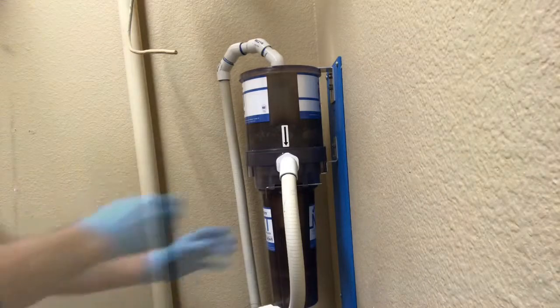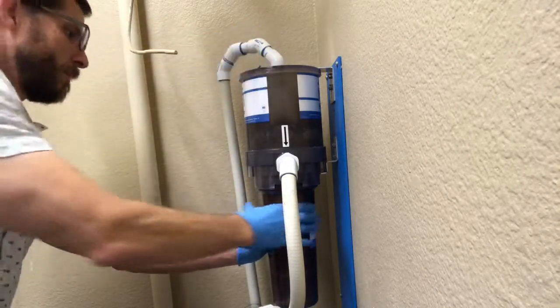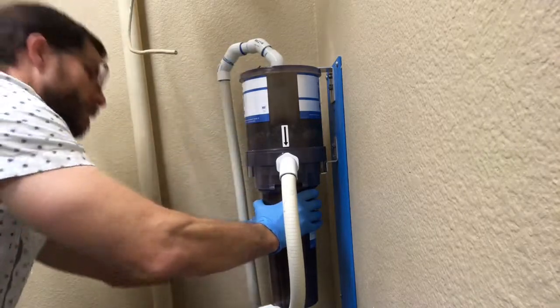Go ahead and set the new canister down, and what you're going to do next is remove these two pins that retain the collection canister into the amalgam separator.